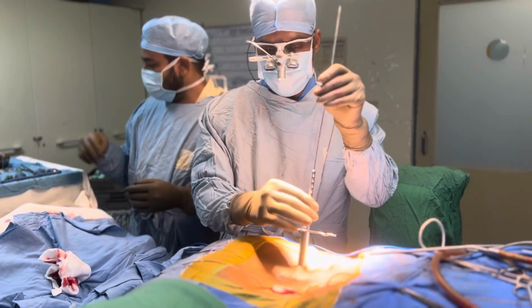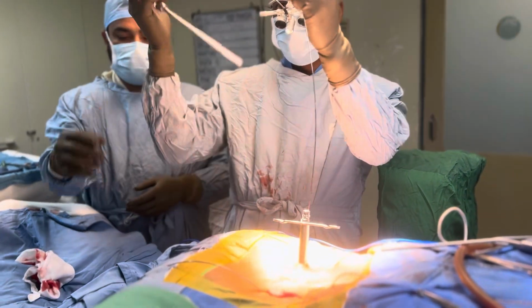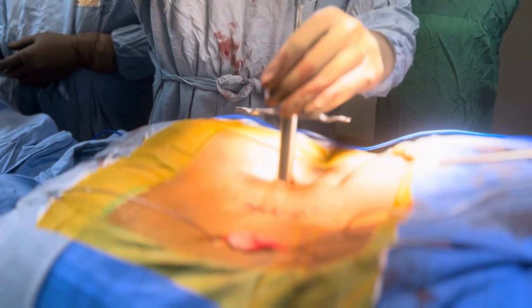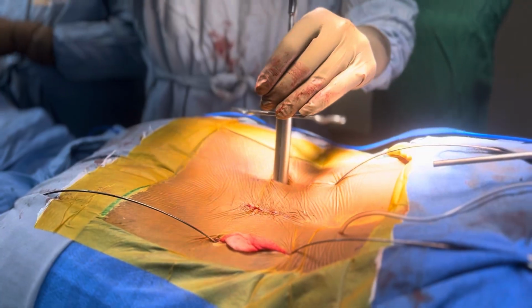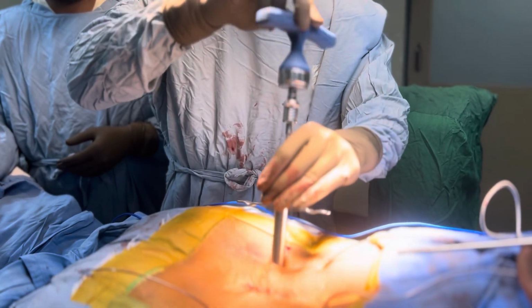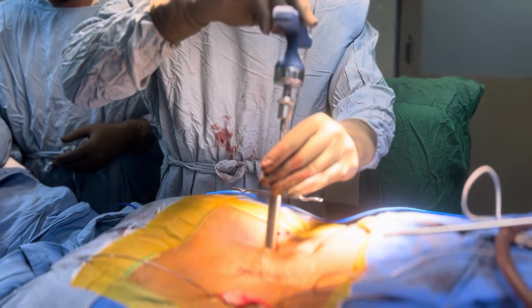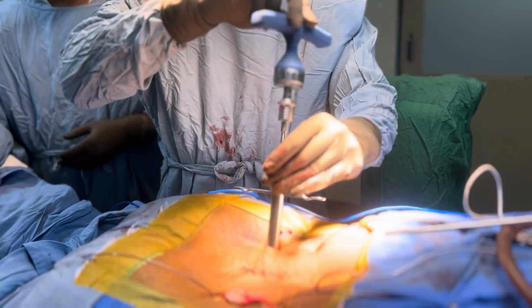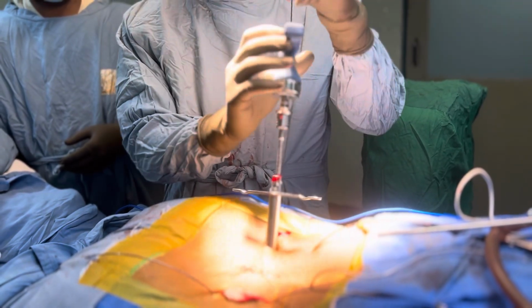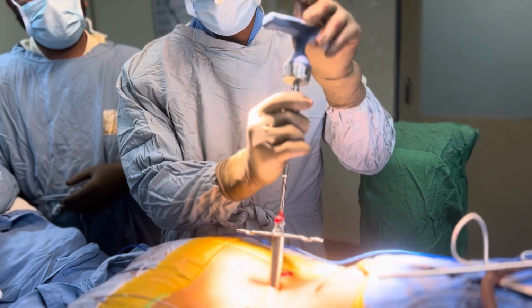Then one needs to remove the first sleeve and tap the pedicle. Now we are going to put the 6.5 mm pedicle screws. I am tapping it with a 4.5 tap. One can tap it with a 5.5 mm tap also. There is no need to see the tap on C-arm. On an average you can tap the pedicle till 30 to 35 mm.